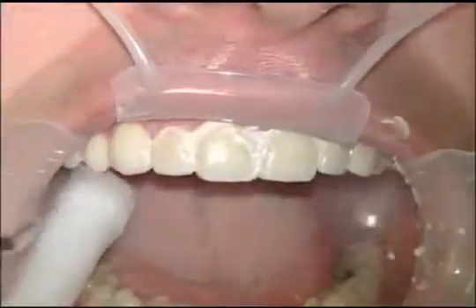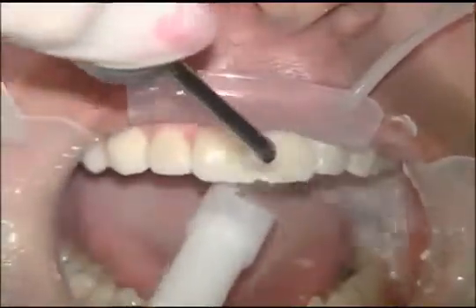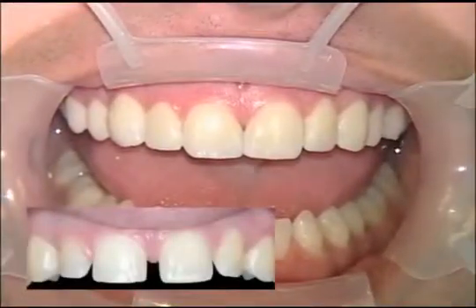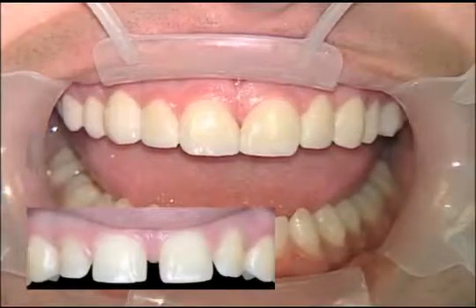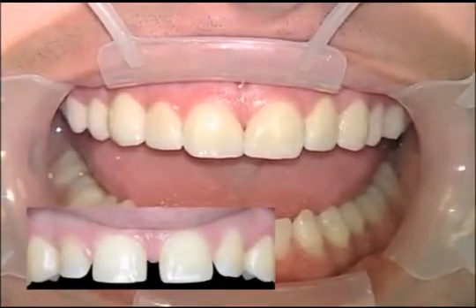When we're done polishing, we're going to go ahead and rinse off the rest of the polish from the veneers and take a look and see how they look and see if we've got anything that needs to be touched up. You can see on the before picture the big spaces that were present before. And this is one of the great times to use a no-prep case when you've got somebody who needs a little additional tooth length, has some large diastemas in between their teeth, because you can accomplish both those goals at the same time.